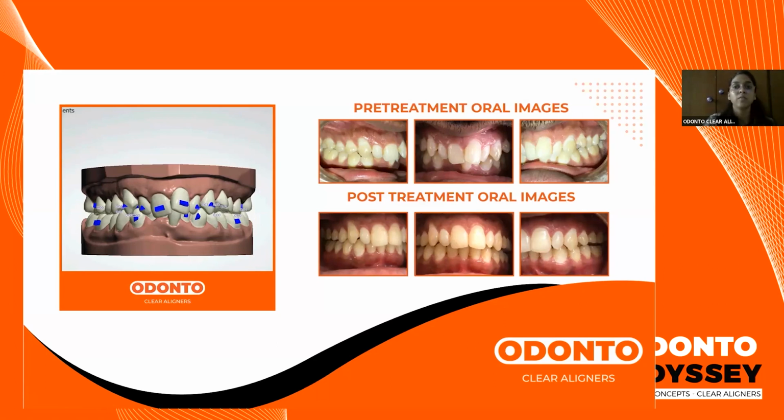Now, this is not one of the ideal cases that you would start with. I would suggest that this is a case you take up after you've had some amount of experience with aligners, with mild crowding cases. Also, if you have that sort of experience, it works out great because you will have confidence as to what you are offering to the patient during treatment progress. You'll be able to communicate better with the patient once you have that experience in hand.